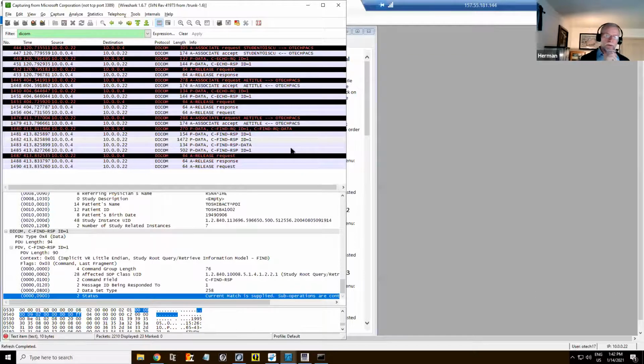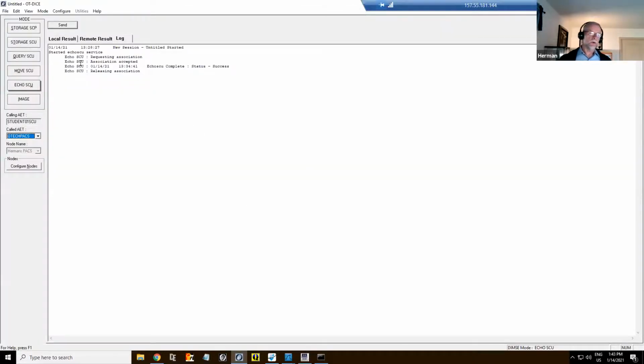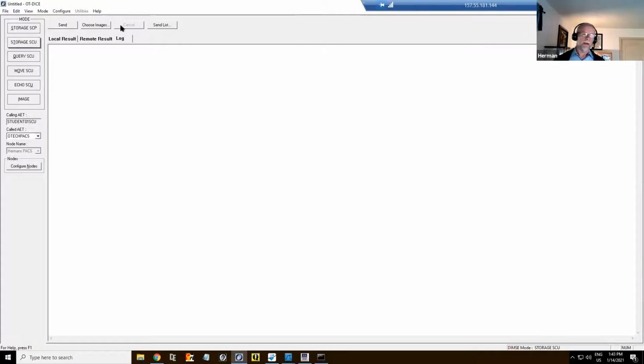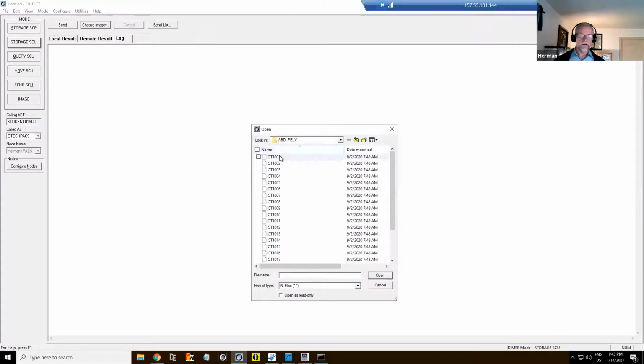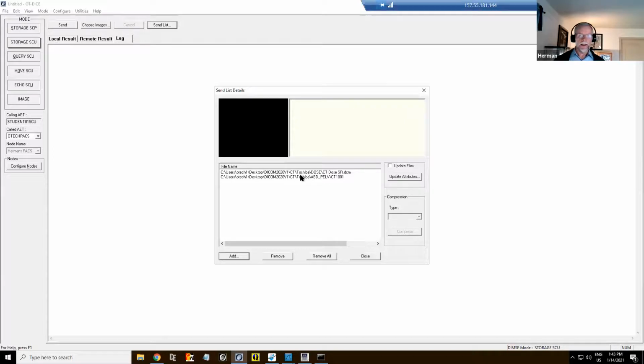Yeah? Before I go a little bit further, I want to make sure that I simulate some typical errors as well. So let's go back to the modality simulator and see whether we can simulate some errors. Here's my DICOM, and what I'm going to do, I'm going to send an image. When I send the image, I do store SCU. I want to send it to PACS. I do a clear first, and I choose my image. I do a CT image, right? Open. So in my send list is a CT image, and also a dose structured report from the CT.